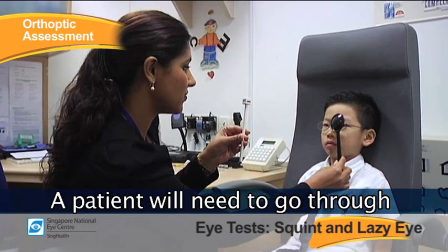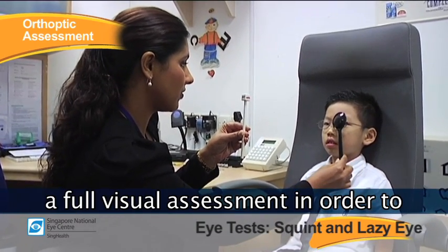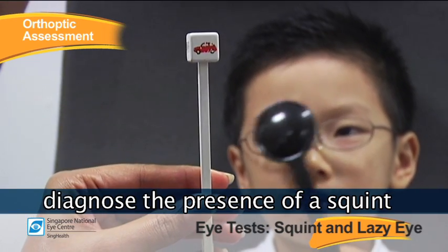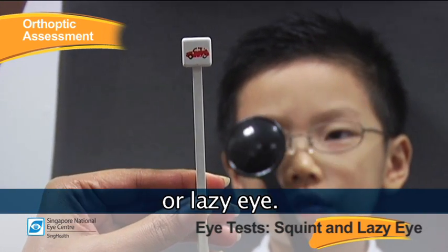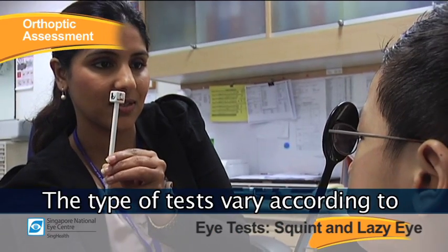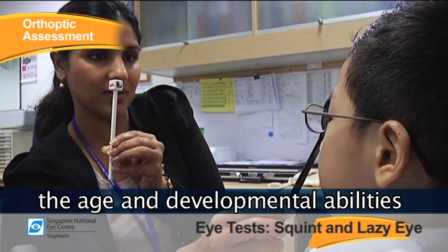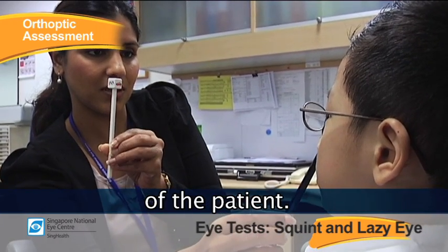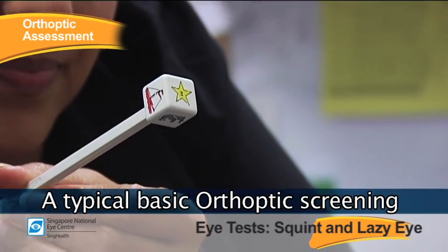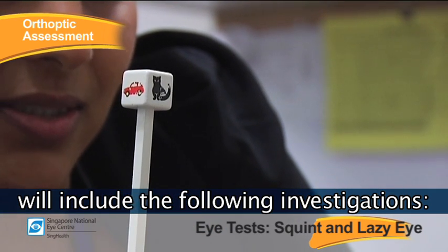A patient will need to go through a full visual assessment in order to diagnose the presence of a squint or lazy eye. The types of tests vary according to the age and developmental abilities of the patient. A typical basic orthoptic screening will include the following investigations.